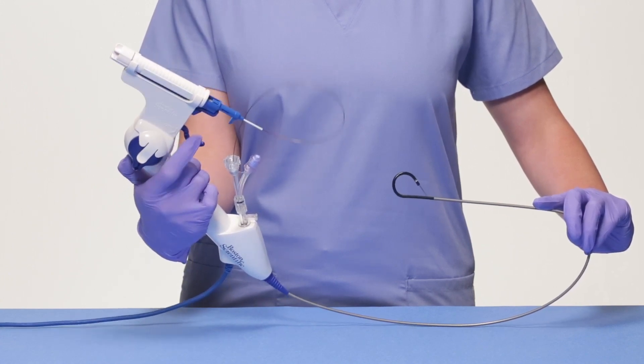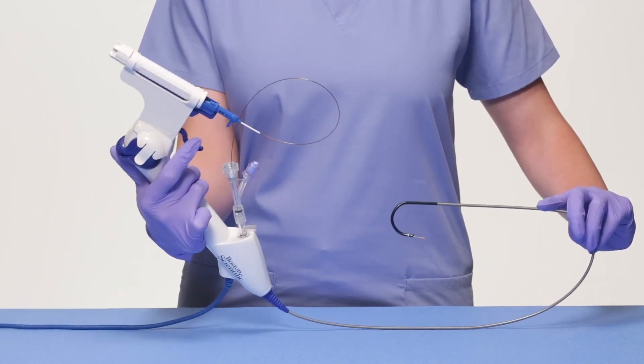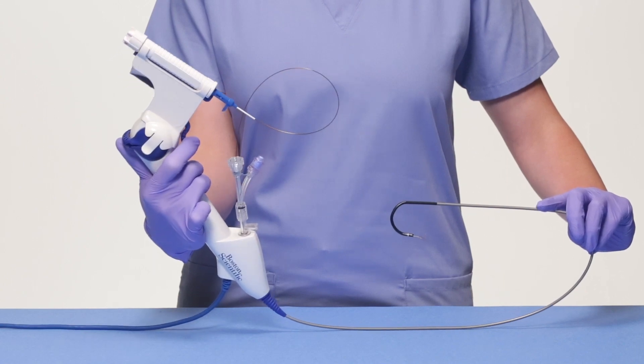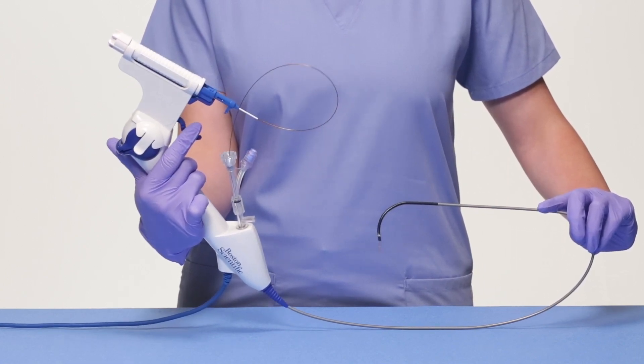When assembled, the LithoVue Empower device will allow for simultaneous scope deflection and basket actuation, all with a single hand.